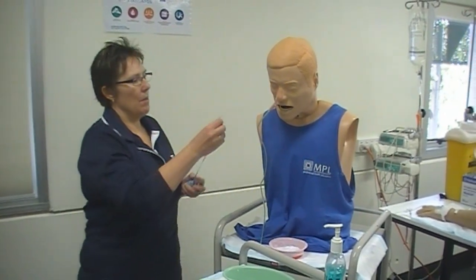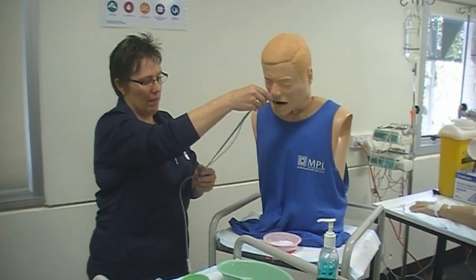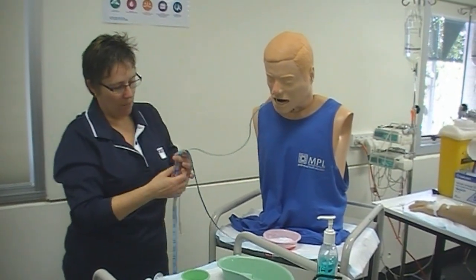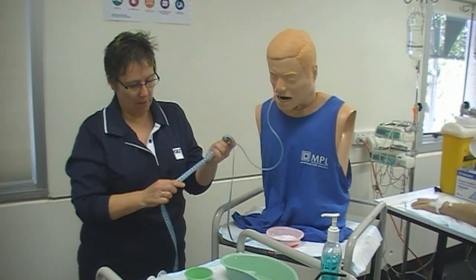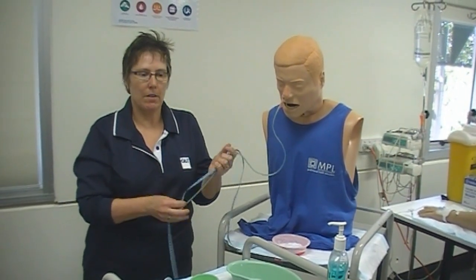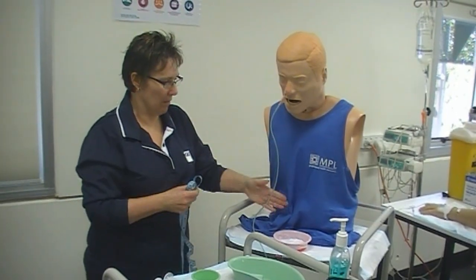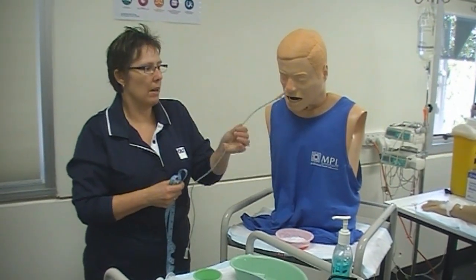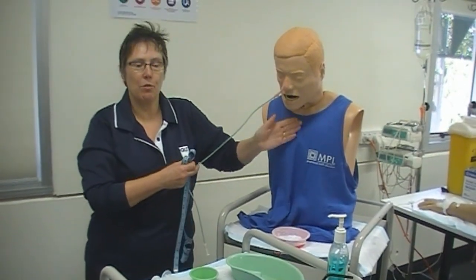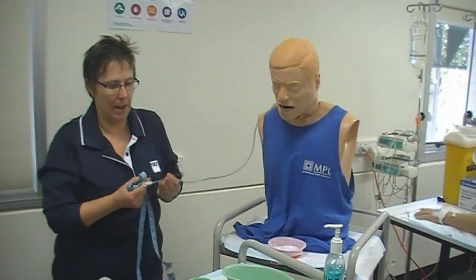Sometimes you will get an x-ray to check the position. Another way of knowing that my tube hasn't moved, once I've confirmed it's in the stomach, is to measure the external length — how many centimetres are actually outside the patient — and record this. In this case it's 71 centimetres. The tube should not migrate inside the body; it can slip up and down the tape, which could position it higher and create a risk of aspiration if fluid were put down it. This check should be done every shift.